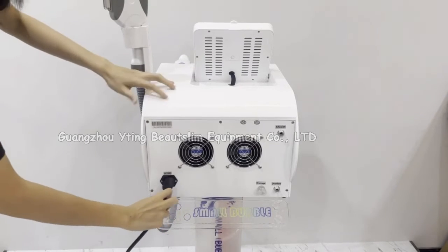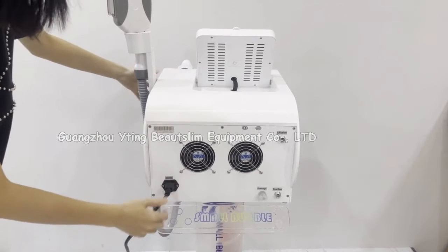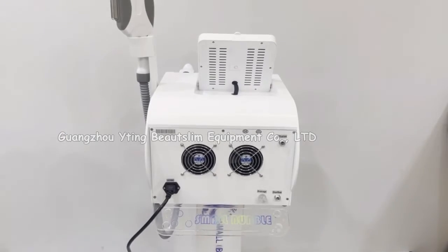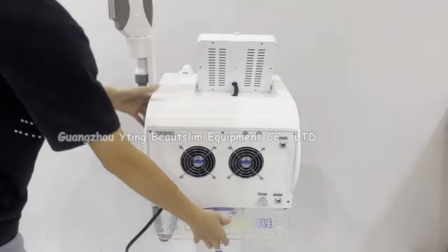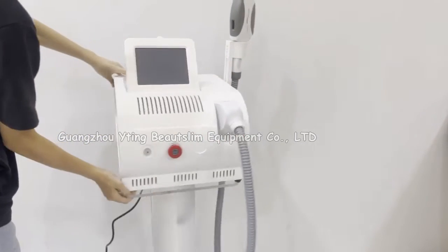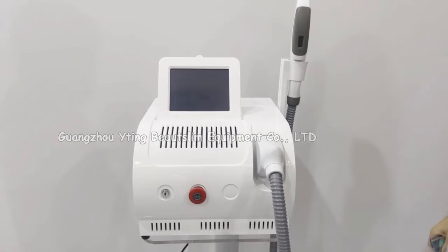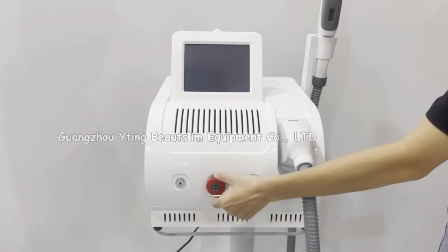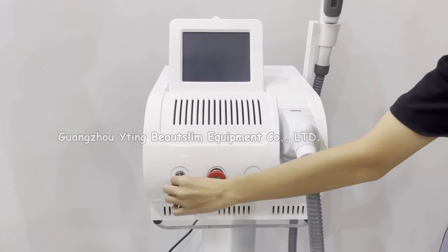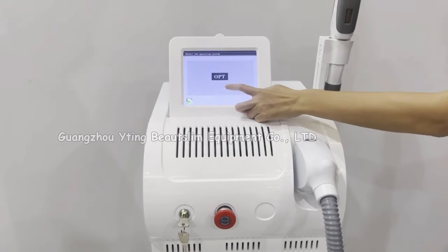Connect the power cord here. Closely rotate this emergency button and rotate the key. Click here.